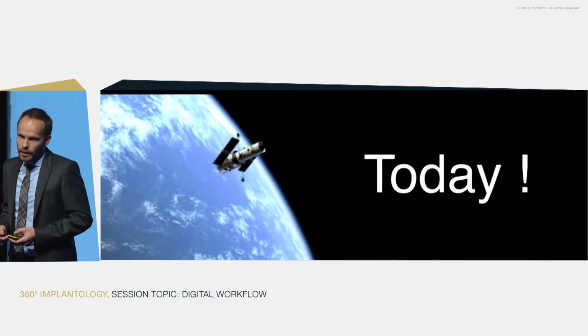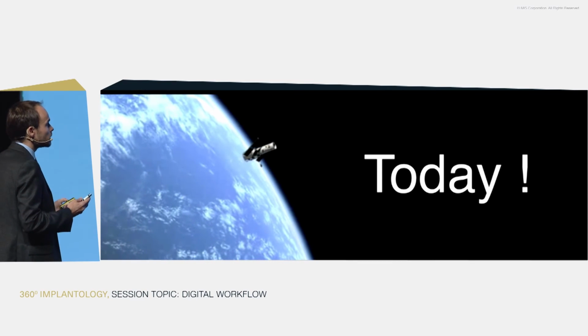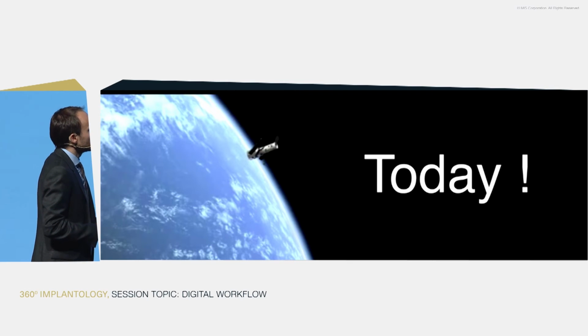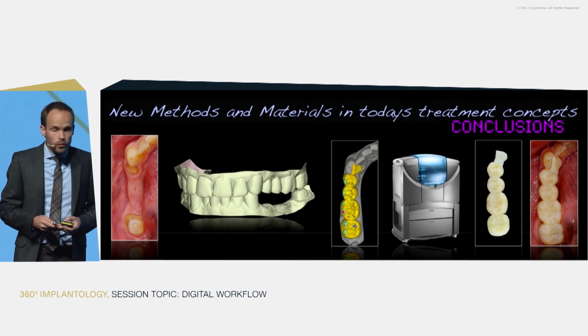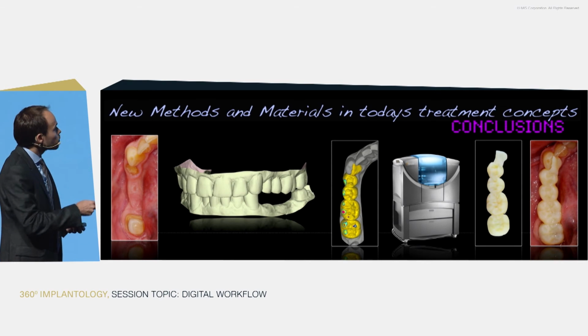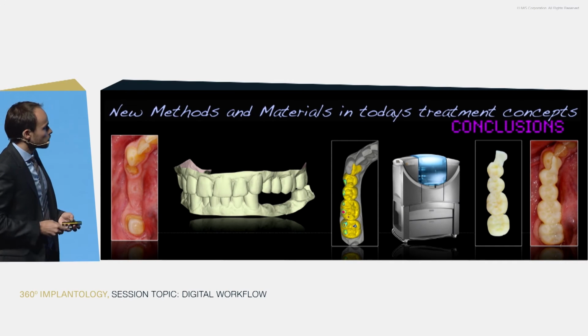And now to summarize, for the last 10 minutes, 3 cases for you, how we deal with the digital workflow in our daily lives in Geneva. And I show you the first case that was actually done back in Zurich. And you see really the straightforward case, 4-unit bridge.